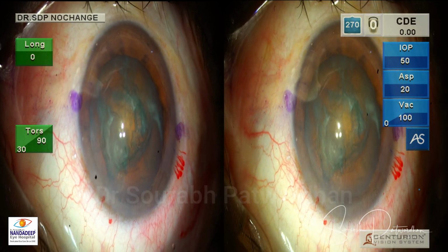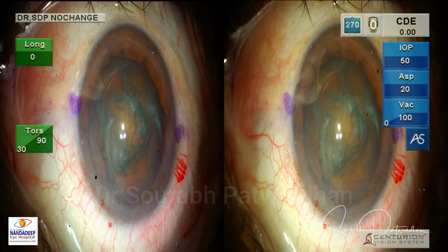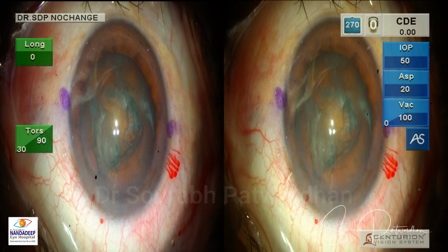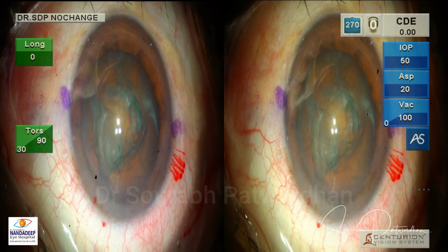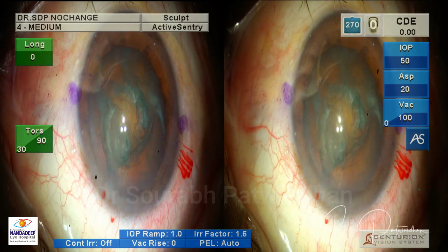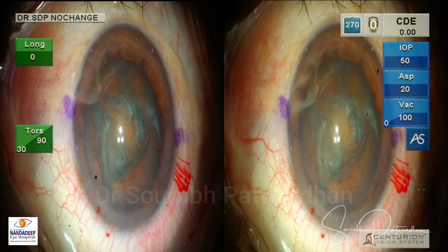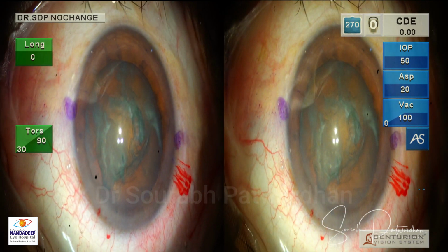So this is a common problem when we operate, that we get fogging. So we generally put a tape around the nose, but in this case I think maybe the humidity is slightly higher. Can you move this handrest aside?